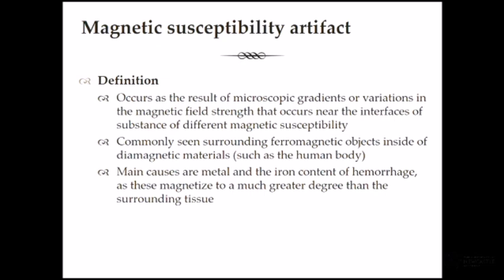The reason we can do that with MRI is that hemoglobin has a different magnetic property depending on whether it's carrying oxygen or not. When blood flows to the brain and it undertakes a task, it strips that oxygen off as part of its energy source. And when the blood has the oxygen removed, it has a different magnetic profile. So we can map that out. That's a susceptibility change.